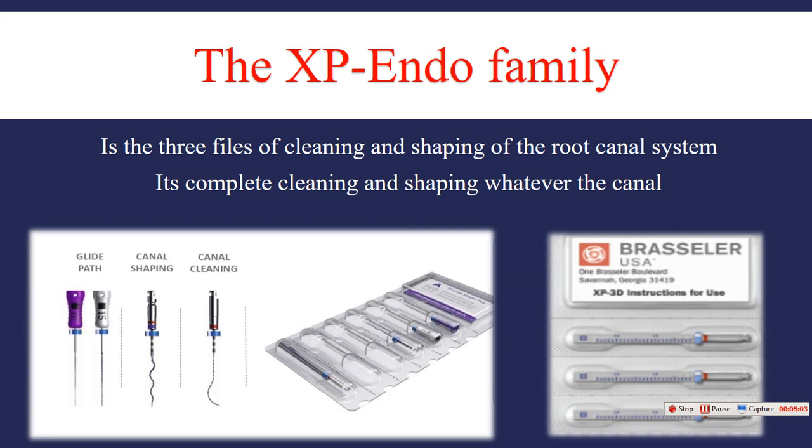The principle of the treatment of the root canal system is the glide path: reaching the working length with a small size, and then using any system in endodontic treatment. We cannot use any system, even a new system, without the glide path, meaning reaching the canal working length with a small size to show the patency of the canal. This is the glide path, the principle of endodontic treatment.